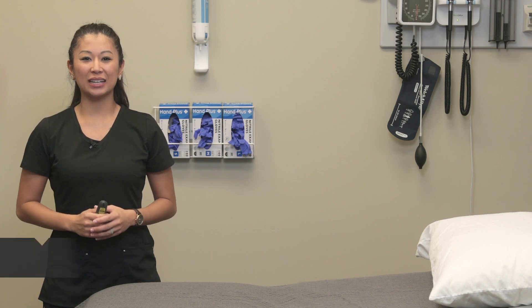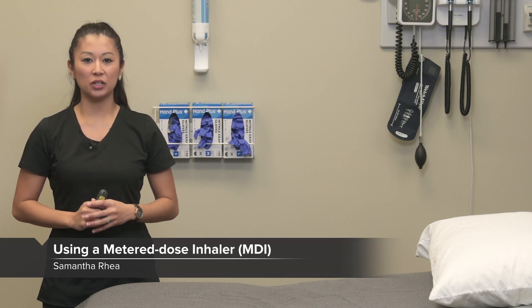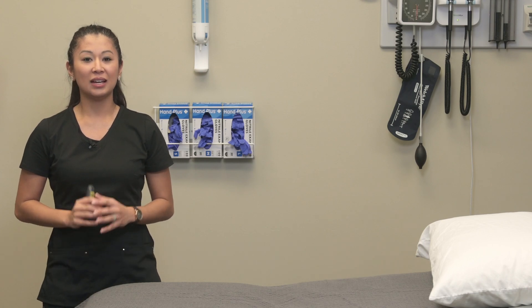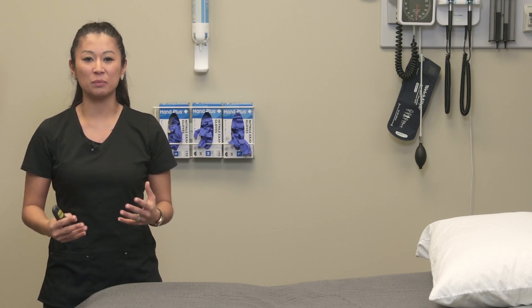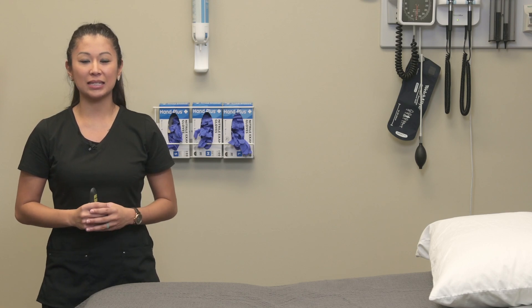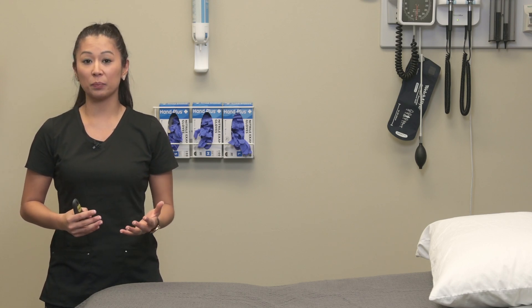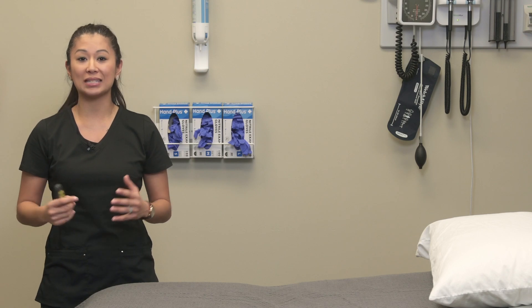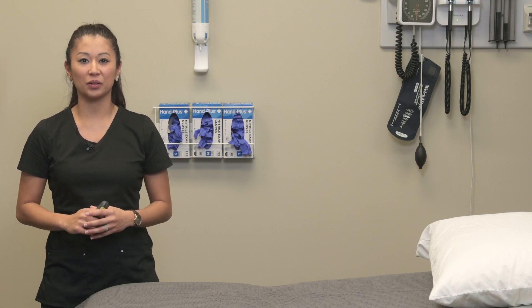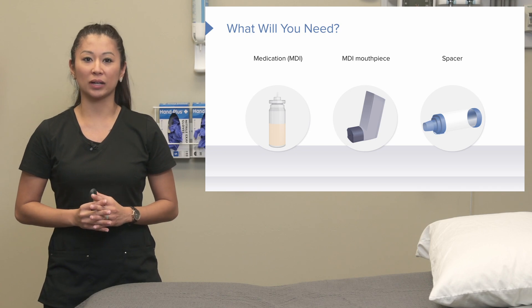Welcome to the skill: inhaled medication administration of a metered dose inhaler, otherwise known as an MDI. This is a skill you're going to use quite a bit for a pediatric patient or an adult patient who has asthma and is using their inhaler.